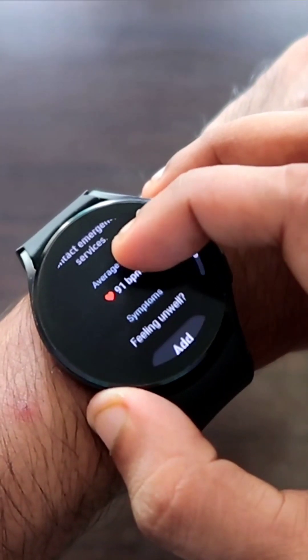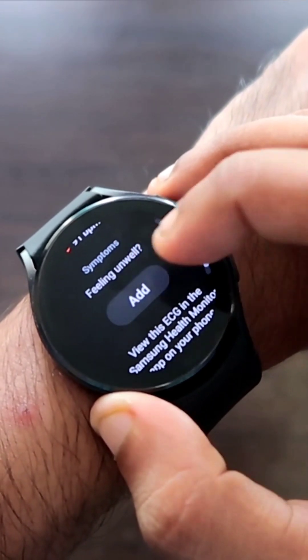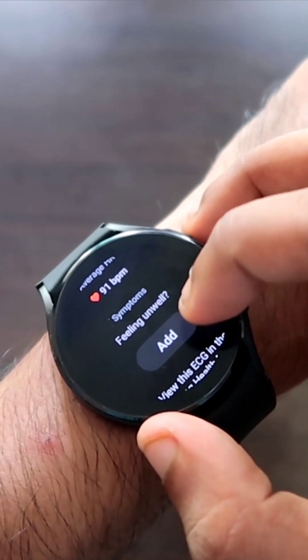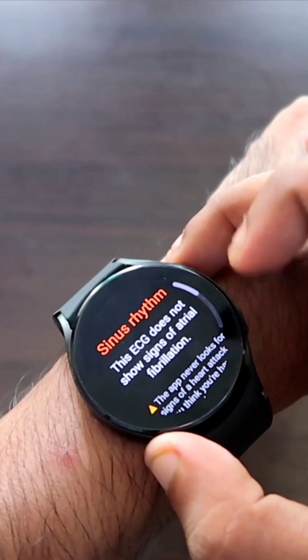Also, if you scroll down, it will give you the average heart rate along with an option to add symptoms if you are feeling unwell or if you have shortness of breath, you can write that in there. And now you can measure your ECG with the help of Samsung Galaxy Watch 4.